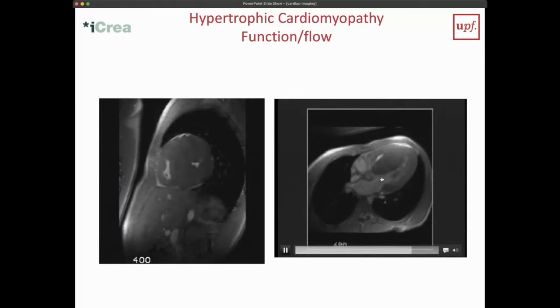So you start to see this kind of blackening here because you have extremely high velocities here. And that's actually because at one side there is a leakage of the valve, and the other side, what I was saying before, is the wall becomes so thick that it actually becomes an obstruction towards the outflow. So you really get flow acceleration there because you start to get a stenosis, not because of a problem with the valve, but because of a wall so thick that it actually starts to obliterate the cavity inside.